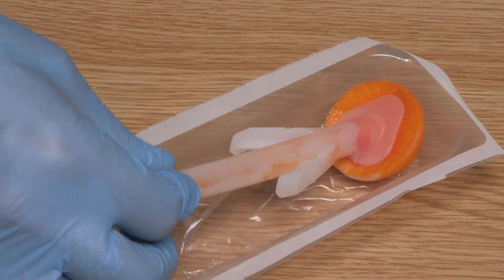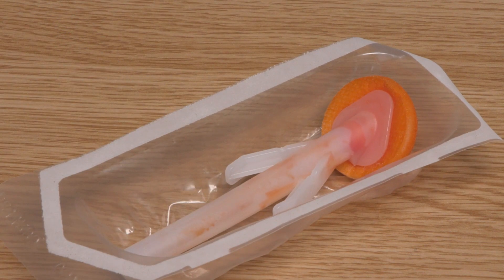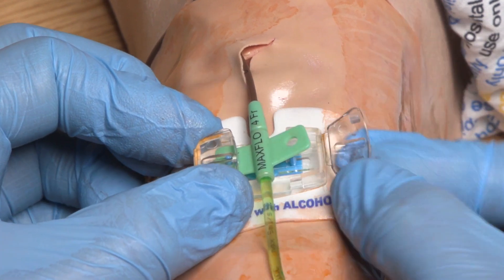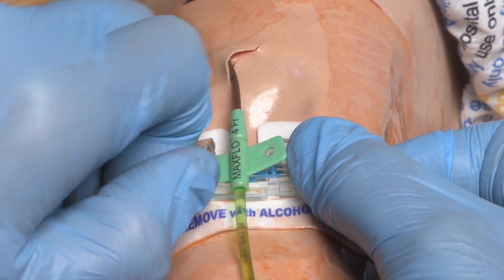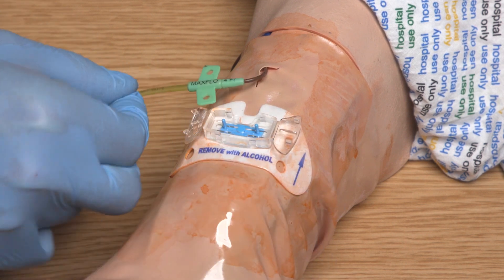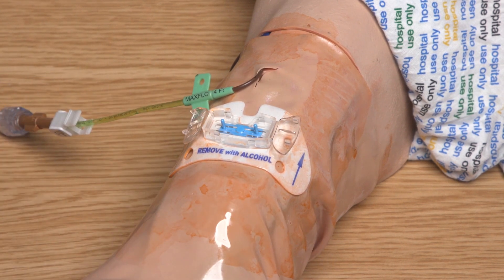I have now placed the wand back into the microcritical aseptic field as I will need to use it again in just a moment. When removing the securing device I need to firstly open the doors at the bottom of the device using my thumbs, and gently lift the catheter off the two blue prongs on the device and tilt it to one side. It is important at this stage to observe the catheter for migration. If you suspect that migration has occurred you should stop, secure the catheter in place and escalate appropriately immediately.